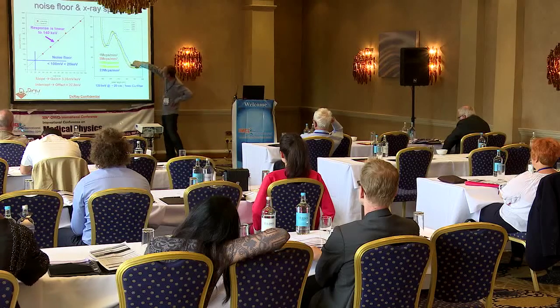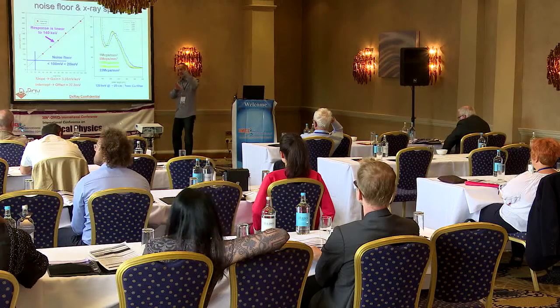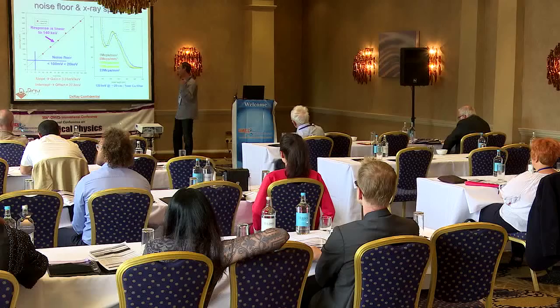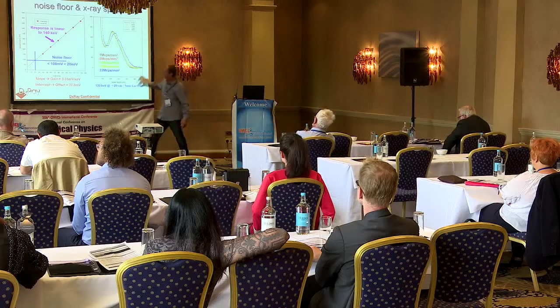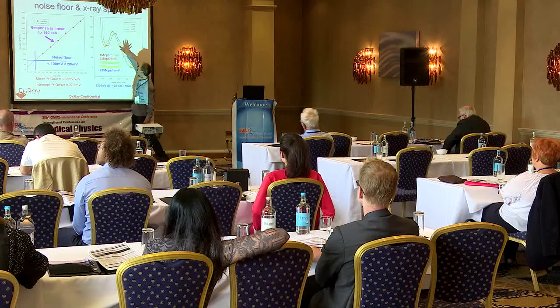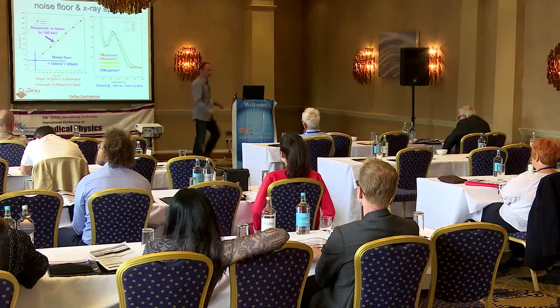Pulse pileup occurs when two X-rays hit the detector within one peaking time and can be recorded as a single X-ray with larger energy. Although when we get near saturation at 23 million counts, you can see that the peak shifts due to the pileup effect.